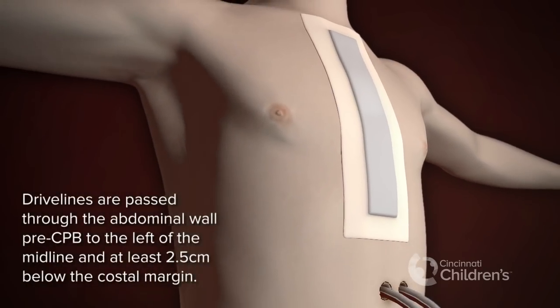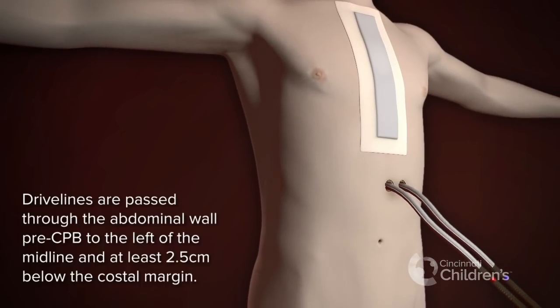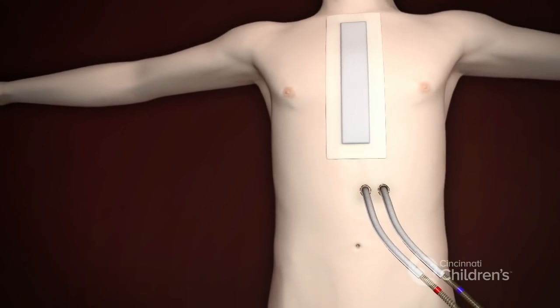Drivelines pass through the abdominal wall, to the left of the midline, and at least 2.5 centimeters below the costal margin.